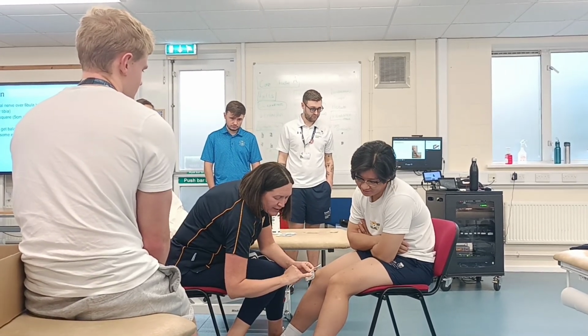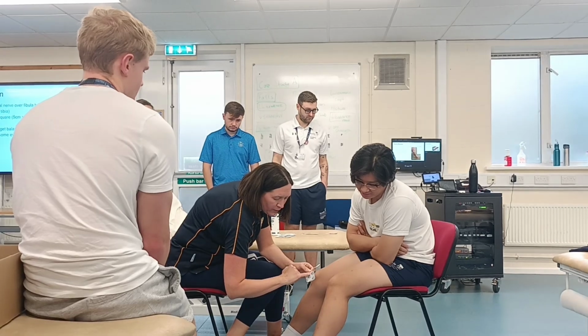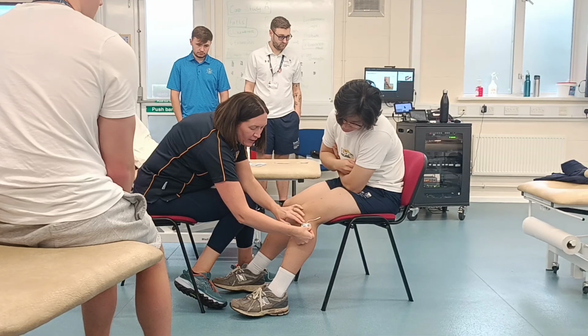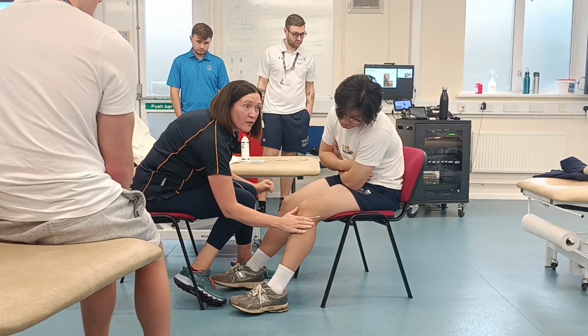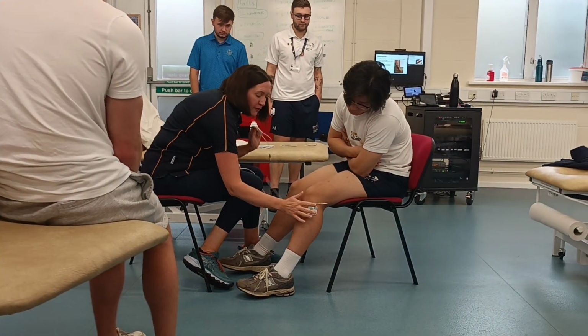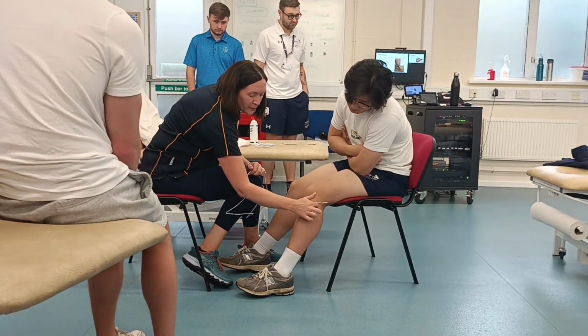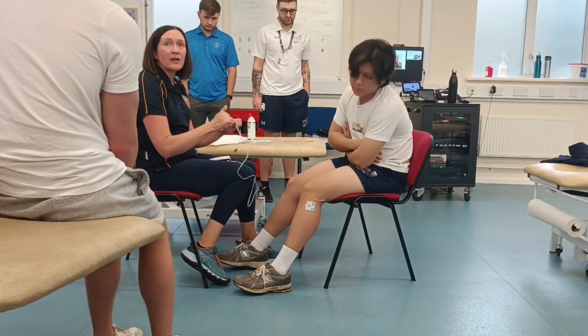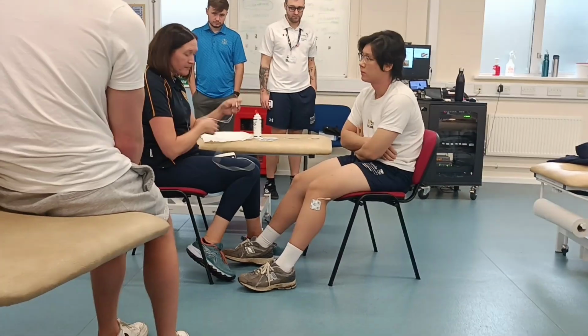I'm kind of visually dividing my electrode into 4. Okay, the top back corner is where I'm aiming for the electrode to go on the fibula head. So that's my fibula head there. If I put that bit over the fibula head, I'm then going to have my electrode on plantar flexors, and I'm going to get the opposite movement to what I'm after.